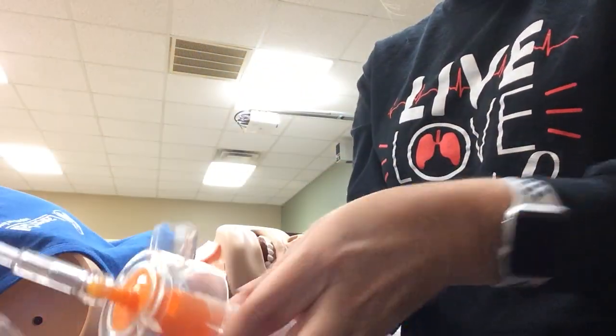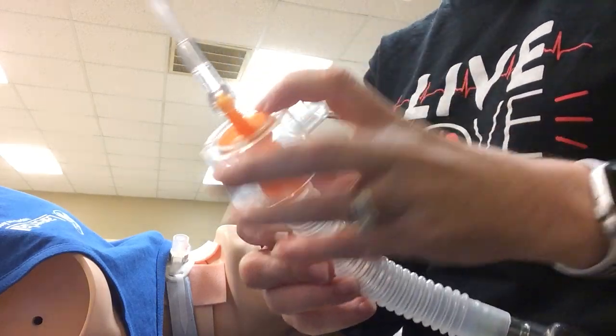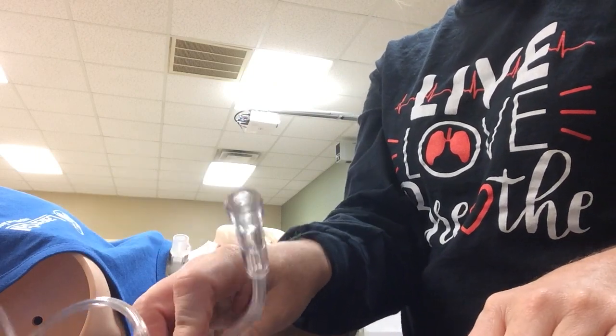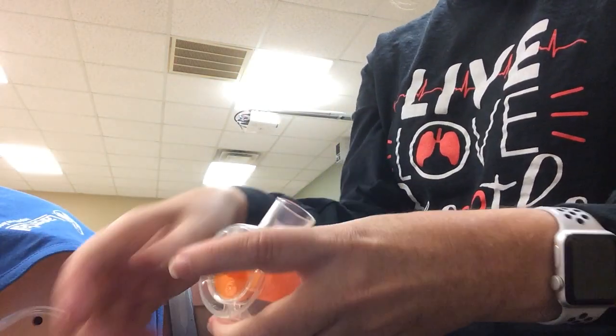Remember, this has an estimated flow. The estimated flow for 50% would be 12 liters. You could start with that and then do your calculation to see if it meets the patient's flow needs. You'll do those calculations with the air entrainment mask and the large volume jet nebulizer.